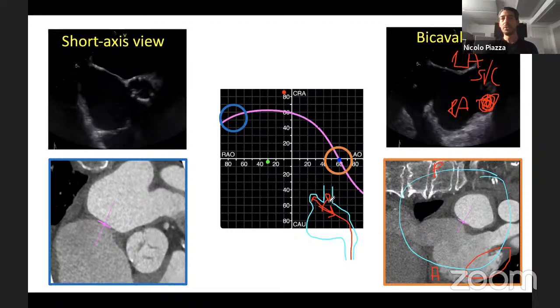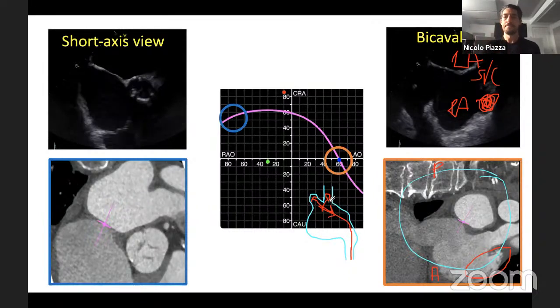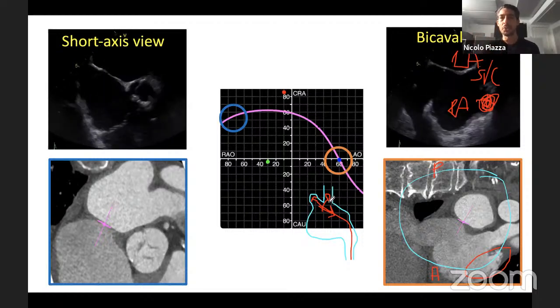Okay, and so all of these little nuances are just so you feel very confident with every move you're making in the cath lab. And you're not just pushing wires because eventually it's going to go somewhere. I know it probably doesn't have any implications to be pushing a wire 100 times perhaps in the right atrium, but still it could be annoying, and sometimes it's nice just to be very direct and very quick when you do things.